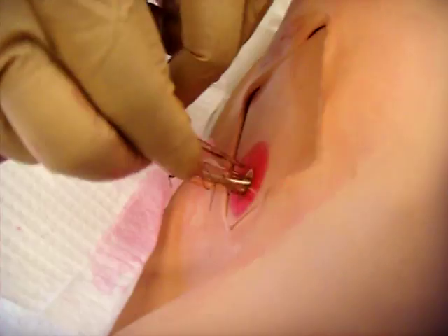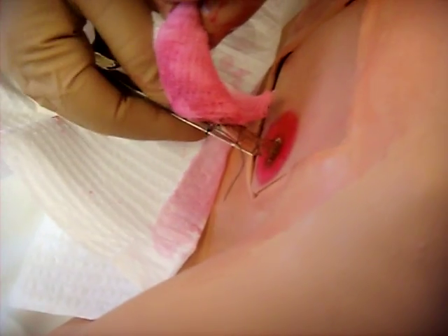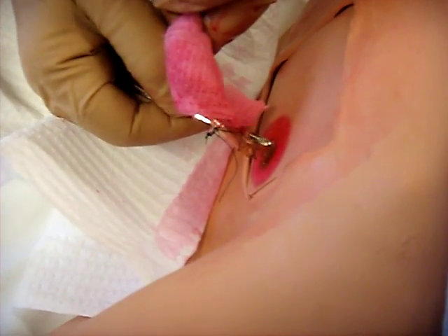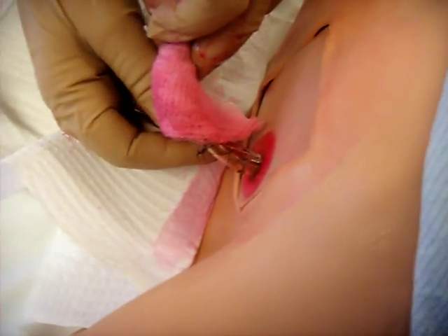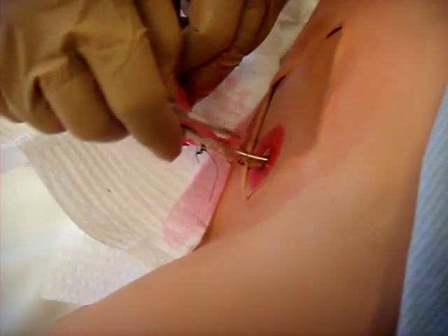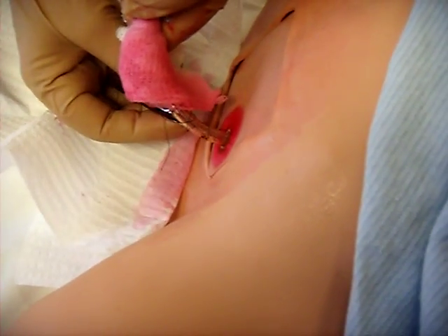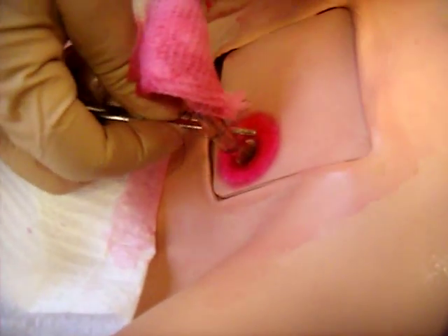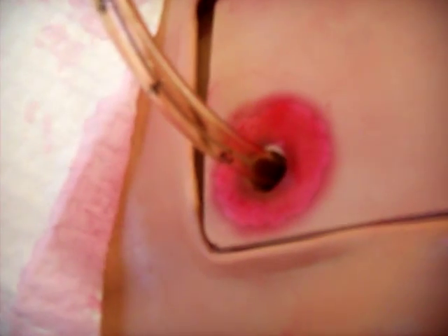All right. This doesn't want to cooperate the way I wanted it to. And you may be doing this for a while. This causes the most stress, I think, for anybody removing the tube, is to find the suture in the proper place and get rid of it. Believe me, these tweezers in these kits are not exactly the ones you'd use in other things. There we go. Okay. That's a real life situation.